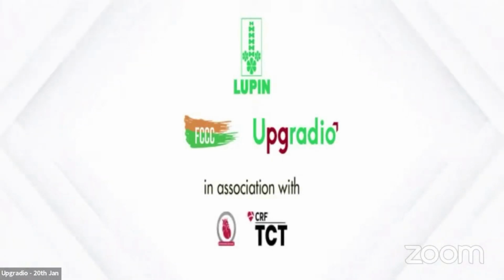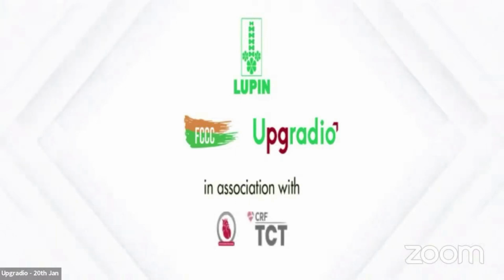It depends upon how you are trained. Most of my PCI initially was around 85% transradial, which now is 95%. There is a concern about 6F for the transradial and 7F with the transfemoral, but now with the 7F, 6F Glidesheath, you can very well place the 7F guide. One can go ahead with the transradial as well.